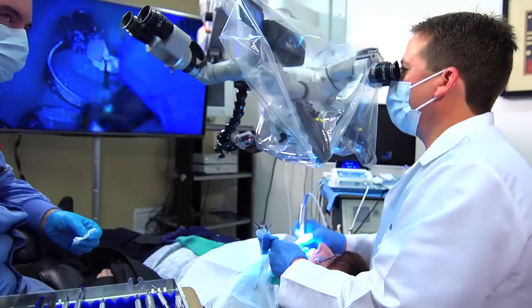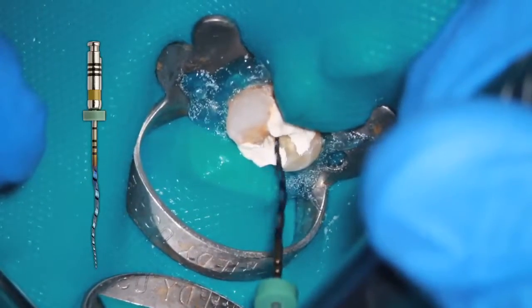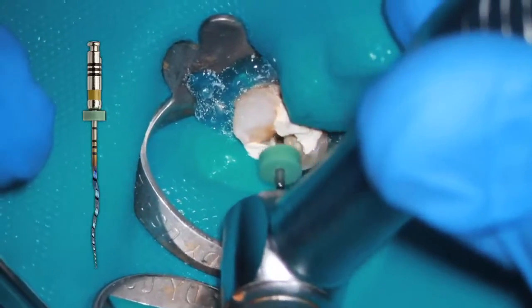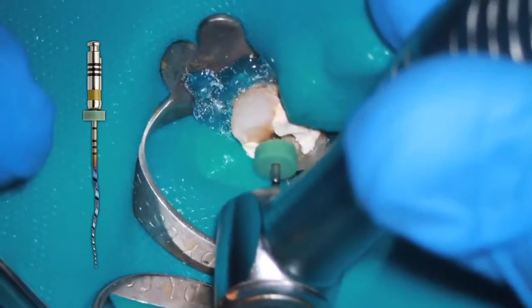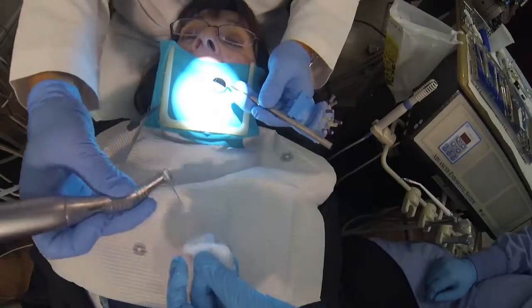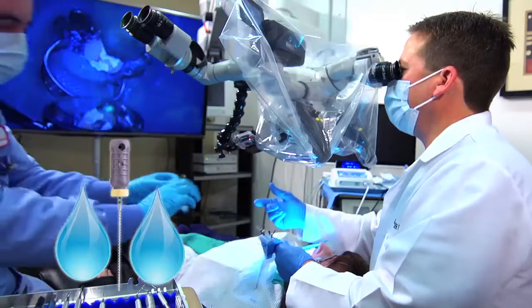So we're going to do a practice, as you can see, no binding when we start it. And here we go, 1, 2, 3, to our working length and out. Clean off the flutes with alcohol, 2x2 with alcohol, irrigate.